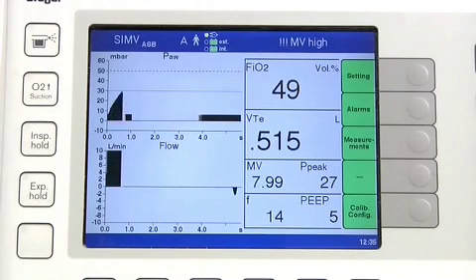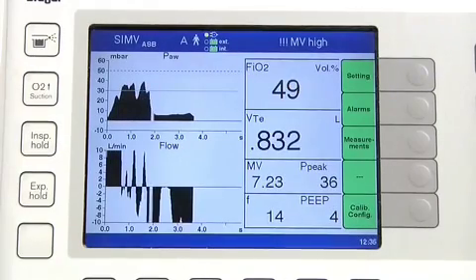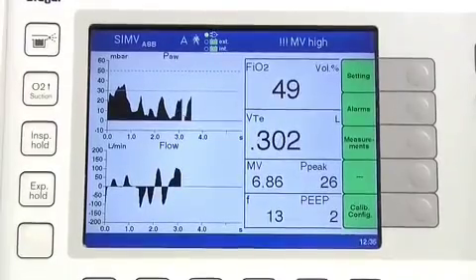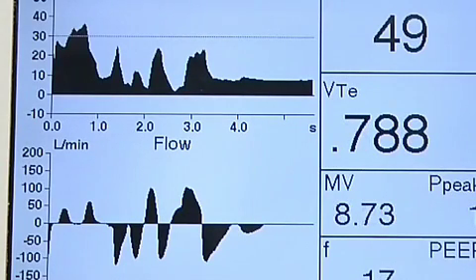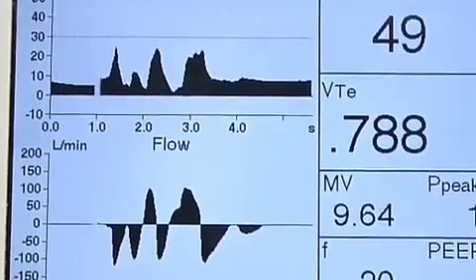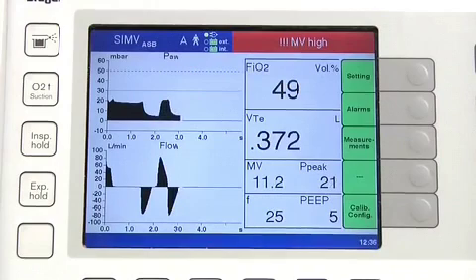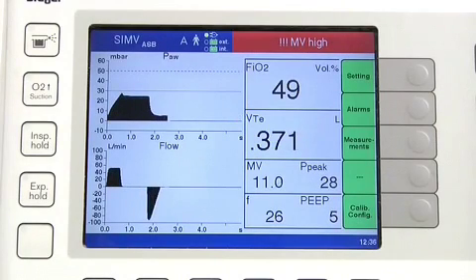The pressure waveform can also help you show if the ventilator is fighting the patient. This can be seen in rabbit ears. If I freeze that waveform, you can see there's lots of rabbit ears. This shows that the ventilator and the patient aren't in synchrony. To rectify this problem, you need to either change your ventilator mode, sedate your patient, or increase their support.